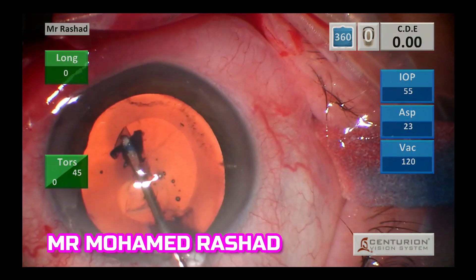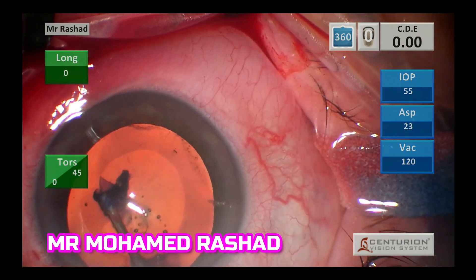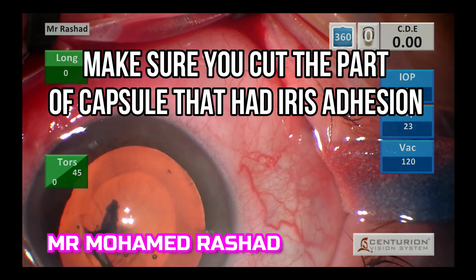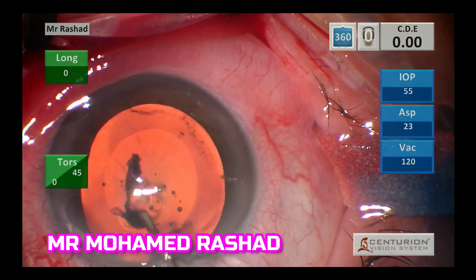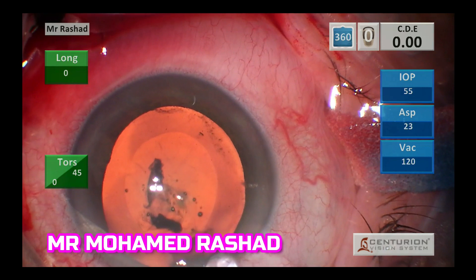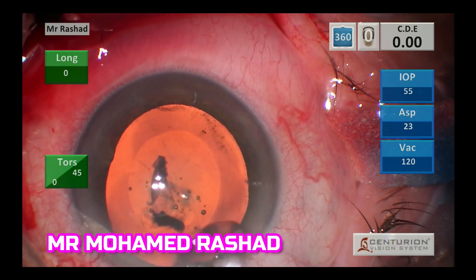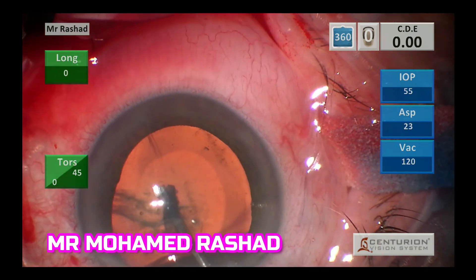Then we do the usual anti-clockwise capsulorrhexis, making sure you are cutting through the part of the adhesion. In these uveitis cases, the uveitis has to be stable for three months before the cataract surgery, and it's better to be on steroids one week before the cataract surgery as well.